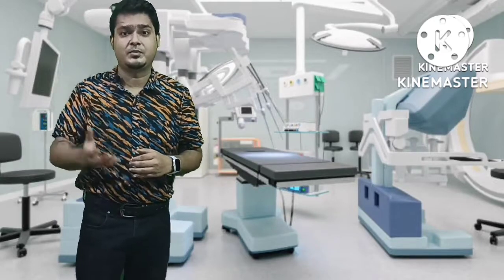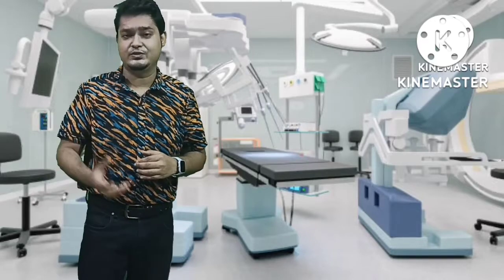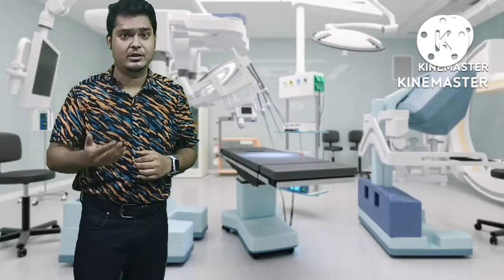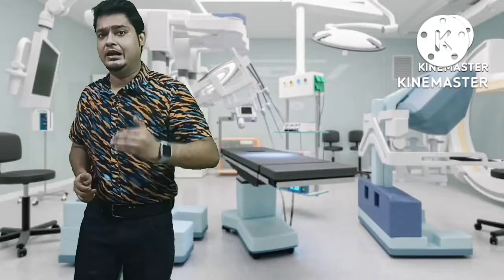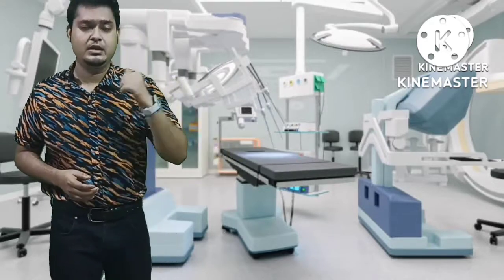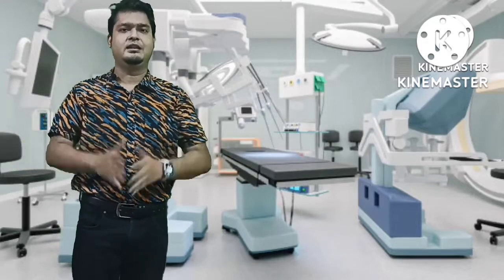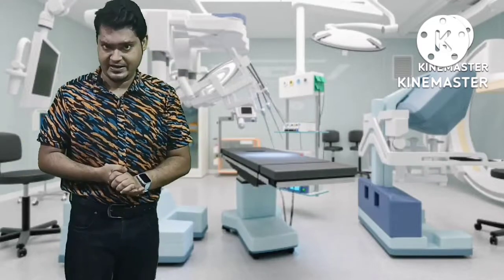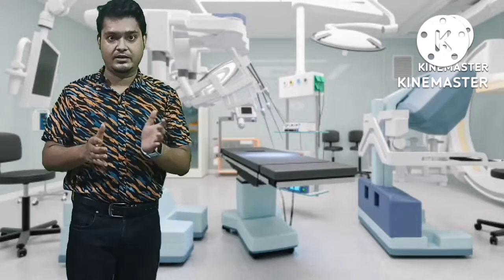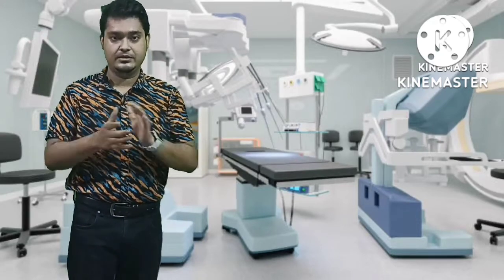Generally, for performing the CT coronary angiography, we are using a contrast amount of about 80 to 150 ml according to the weight of the patient. But in catheter coronary angiography, generally 20 to 40 ml is enough. Okay, so this is the main disadvantage and advantage between these two.